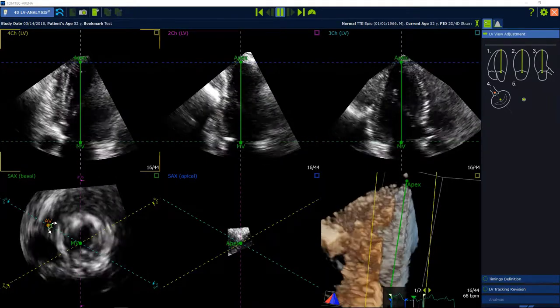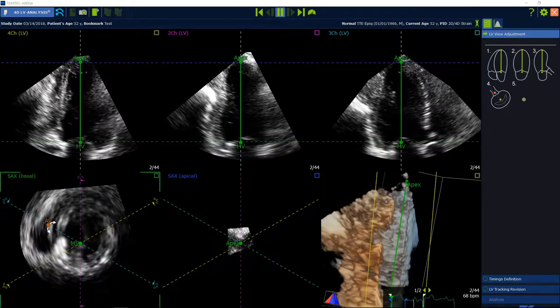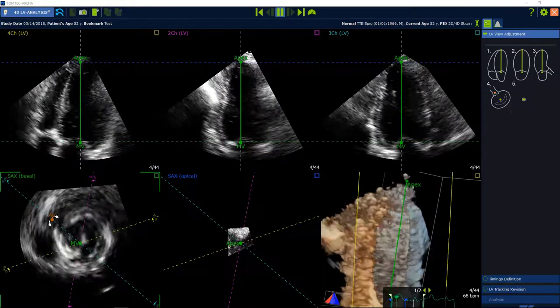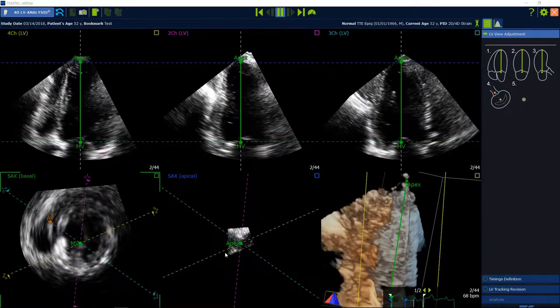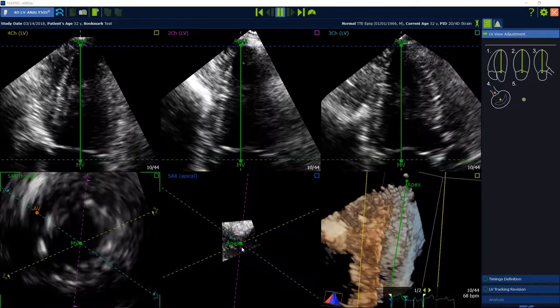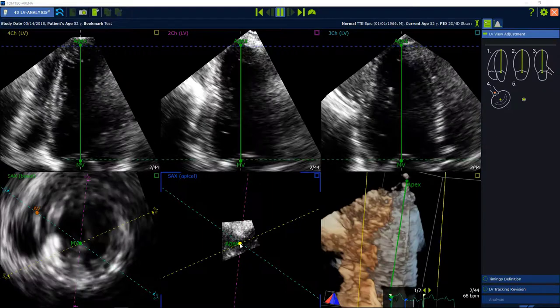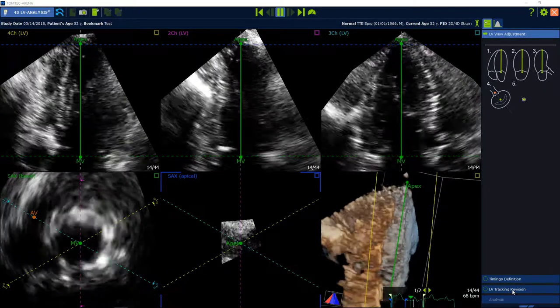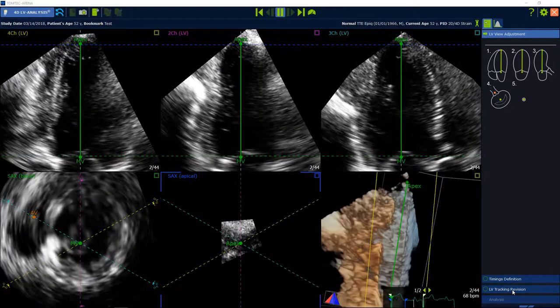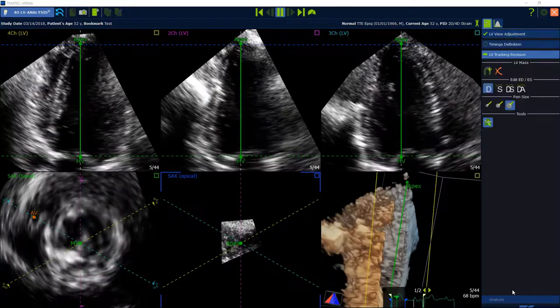Step 4 is rotate to slice through the left ventricular outflow tract. Step 5 is check the apical midpoint. Then go ahead on the right side in the workflow LV tracking revision.